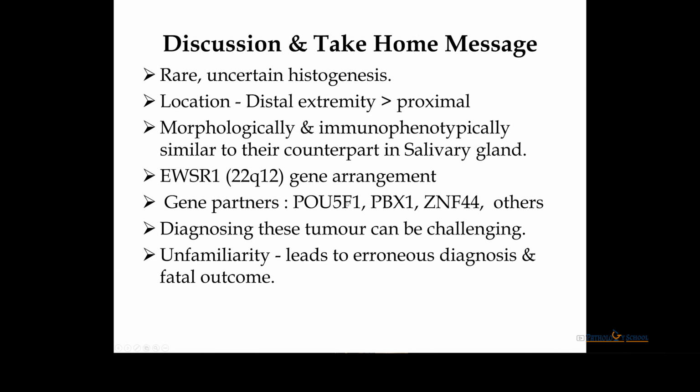So the take-home message in this case is, if you come across a mass over the lower extremity with varied histomorphology, epithelioid tumor cells, and abundant myxoid stroma, you should always keep myoepithelial carcinoma in your differential diagnosis.